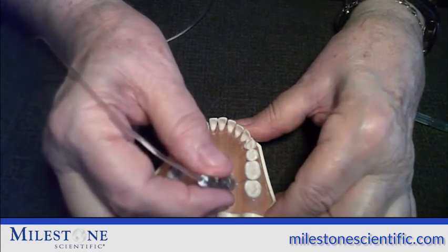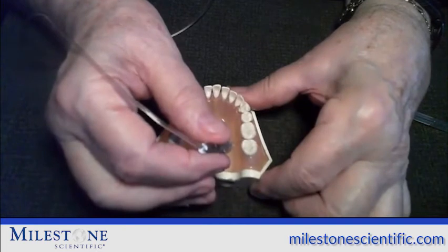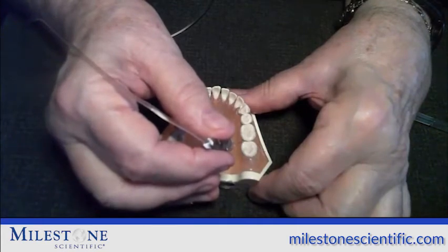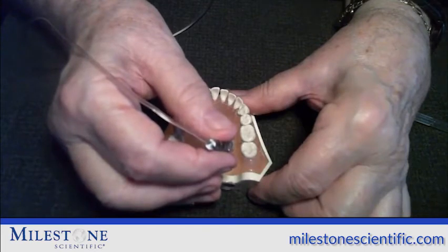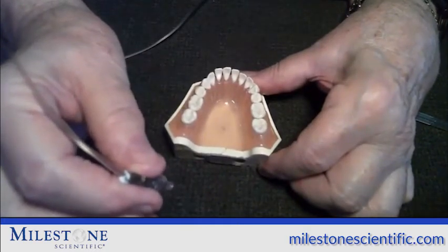Hold the needle in place and deliver the desired amount. We normally recommend a half cartridge of lidocaine, or if using articaine, one quarter of a cartridge. When you hear the instrument's sound indicating how much anesthetic you've delivered — for example, one quarter is beep, beep, gong; a half is beep, beep, gong, gong — you need to pull out. To pull out without getting anesthetic into the patient's mouth, hit the foot pedal, release it, go into aspiration. During aspiration, after the third beep — beep, beep, beep, one, two, three — take the needle directly out of the tissue. Put it on the patient's bib or bracket table and watch how much anesthetic comes out as the aspiration cycle finishes.